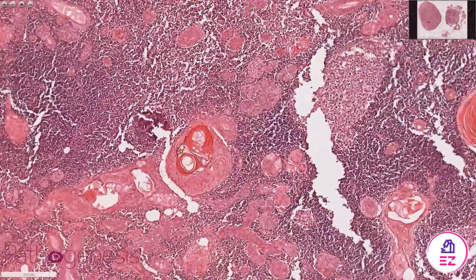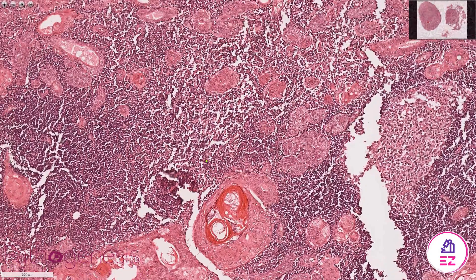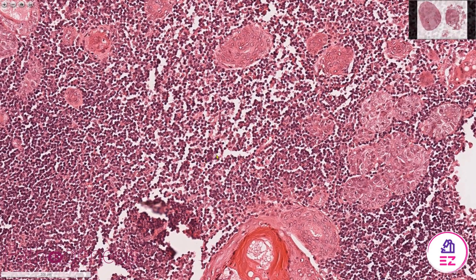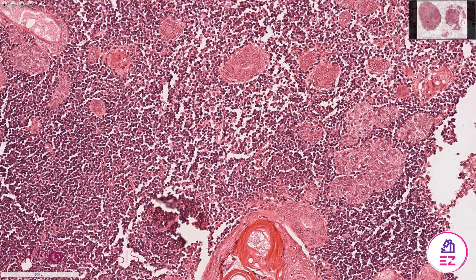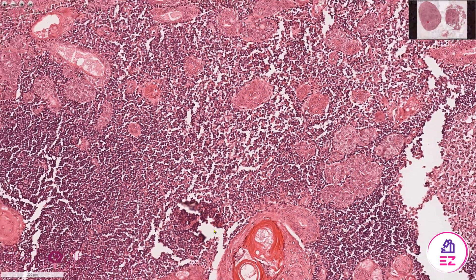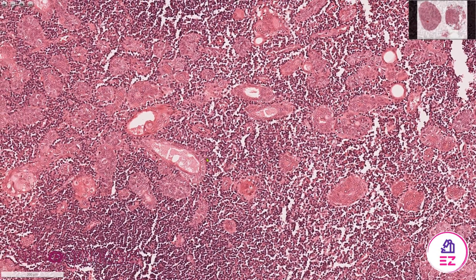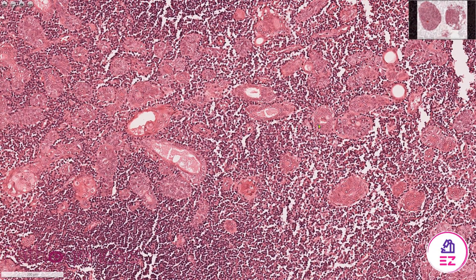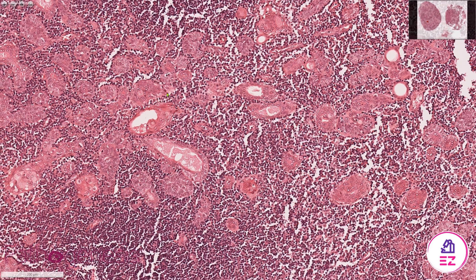When we zoom in, you'll see why this tumor gets its name. The 'lymphadenoma' aspect is because it has this very well-formed lymphoid stroma, and it's an adenoma because it has these little duct-like structures being formed — these little nests of cells that look a little bit like a basal cell adenoma in places, but we've definitely got adenomatous proliferation.